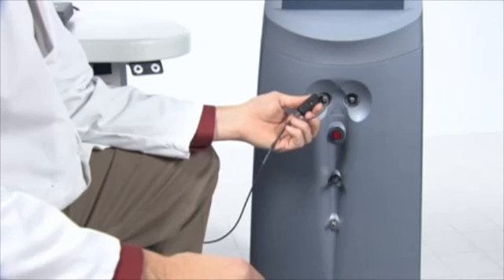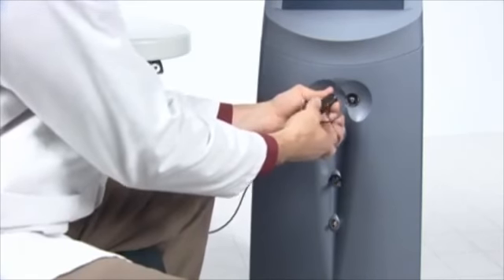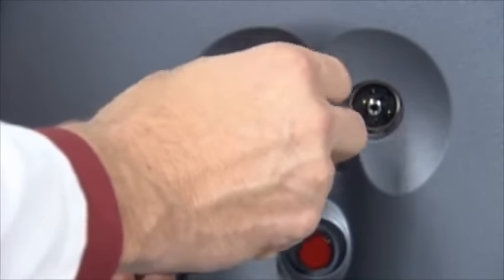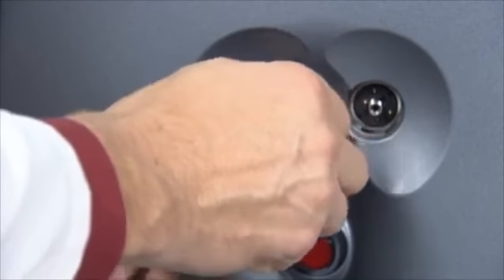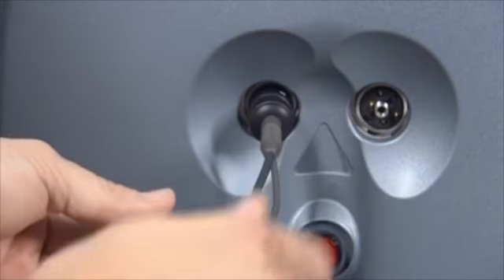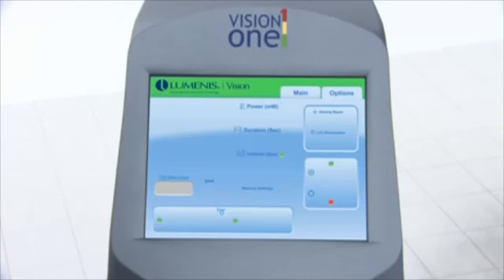To connect a delivery device, attach the delivery device laser connector to either fiber receptacle on the front of the laser console. If using a compatible laser indirect ophthalmoscope, you may also connect the LIO illumination power receptacle on the front of the laser console. Refer to the appropriate delivery device operator manual for detailed instructions on the use of the delivery device.